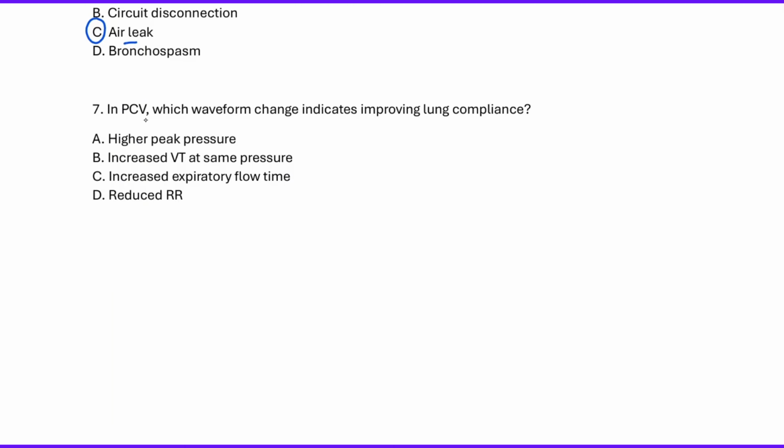In pressure control ventilation, which waveform change indicates improving lung compliance? So if the lung compliance is increasing and you are not changing your inspiratory pressure, guess what? That means if the lung compliance is improving, guess what? Yes, the tidal volume will be what? Increasing. So there has to be increase in tidal volume even at that same what? Pressure, because your lung compliance is improving.